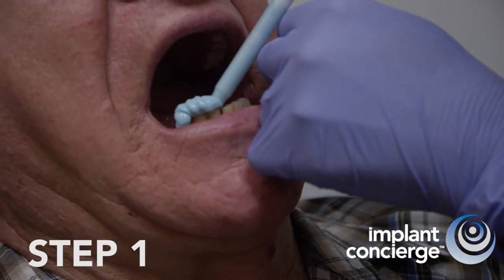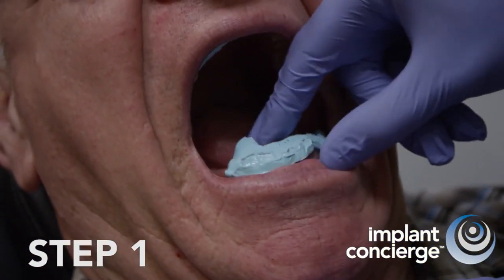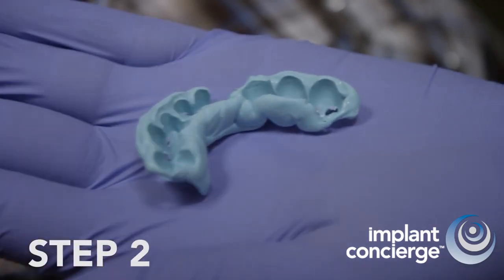First, create a bite registration using blue mousse or similar material. Step 2.